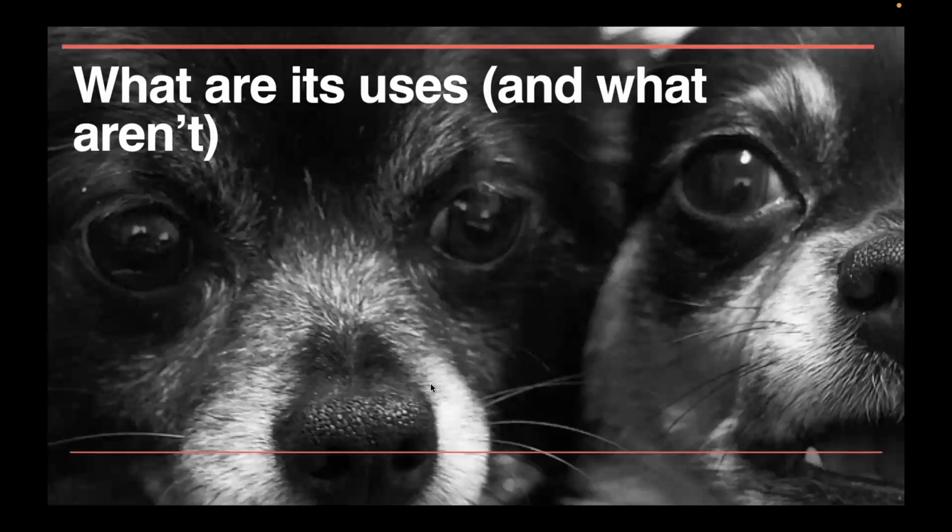So now we will overview the clinical applications of laser therapy with a couple of examples. And right after that, we'll discuss dosing. So you are in that 35% of people who know what dose they are using with their patients. Because the effects we have mentioned on tissue metabolism, blood flow, inflammation, and pain are general treatment goals in many pathologies, in many conditions. So laser therapy is very versatile, and we can incorporate it into the treatment of many conditions.